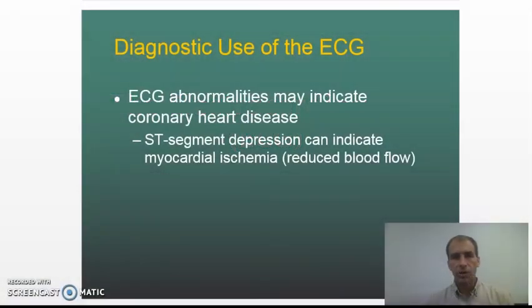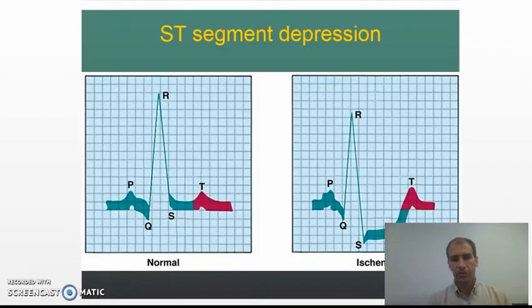Okay, so in this video, we're going to look at a more practical use of the EKG and basically what happens, why do we use this, and what happens if things go wrong, and what if the normal heartbeat isn't normal. And so I'm just going to walk through a few things that we can see and how we use the EKG in very practical purposes.